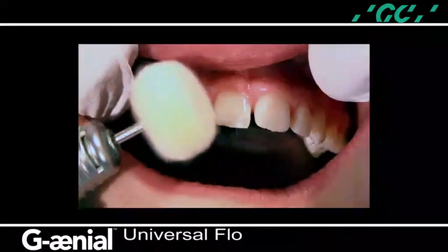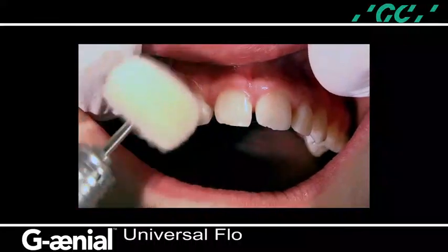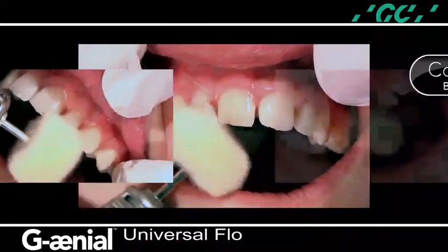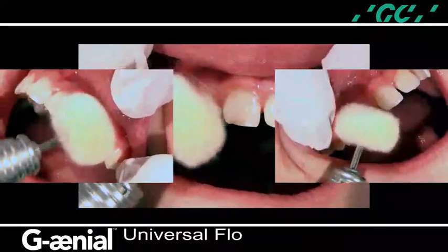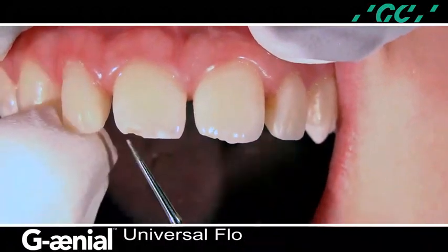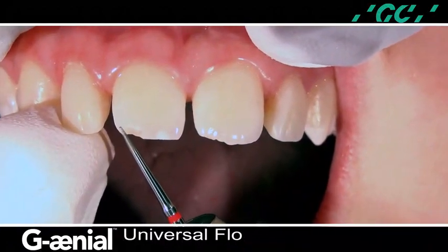The composite surface gloss can be further enhanced by using a dry cotton buff with an intermittent staccato motion at slow speed, approximately 4,000 to 6,000 RPMs. On the incisal fracture of the maxillary right central, the same restorative shade and biomaterial is utilized.